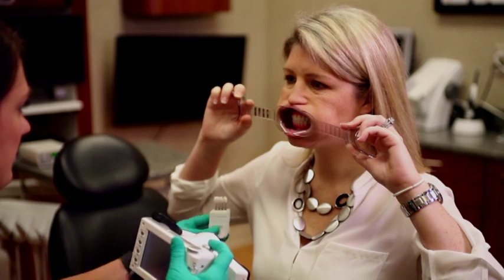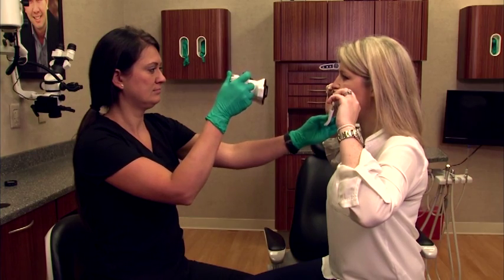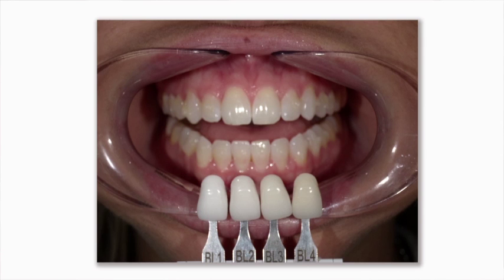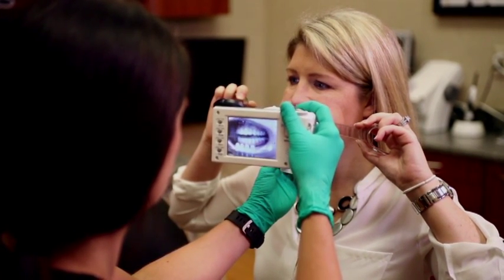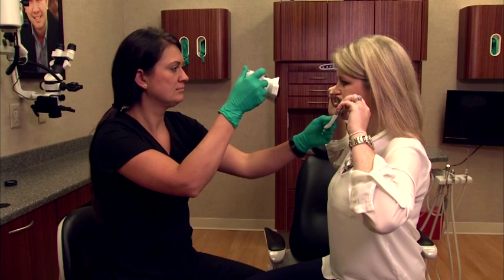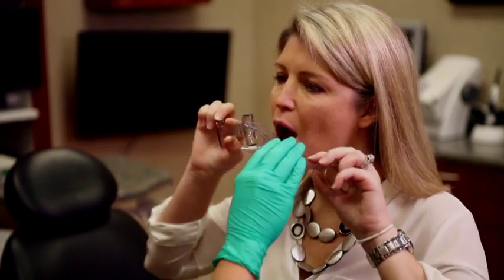With the patient sitting on the side of the dental chair and with proper retractors, get about five inches from the patient. Hold the shade tab up to the tooth you're shooting and take the picture, shooting a couple of different angles. Shoot from the frontal view, then from the side view, and then drop the chin down and shoot from up top — the different angles help the technician see not only color and contour but also some of the translucencies. That will give you great communication with your dental laboratory.